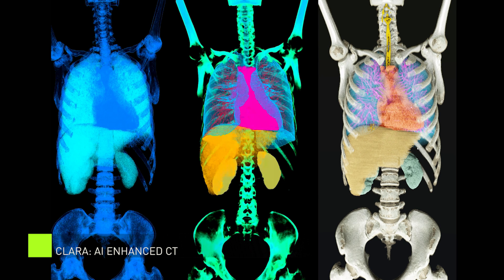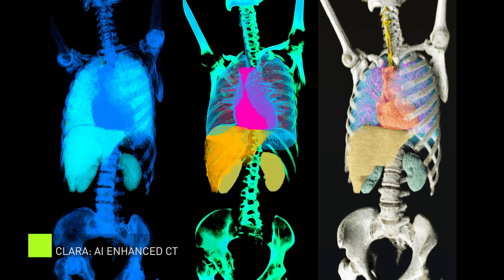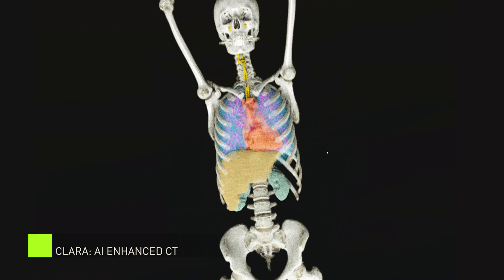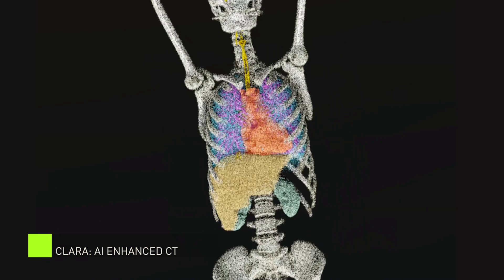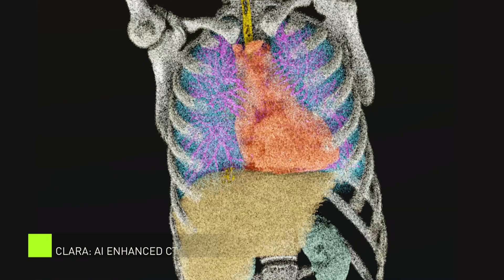Different tissue and organs here generate different density values. By using these densities and applying AI, we can now isolate specific parts of the body and present views that were previously unattainable through traditional medical imaging.